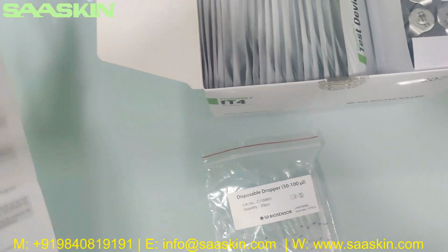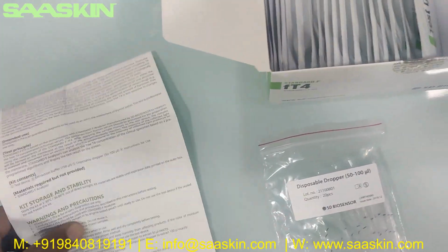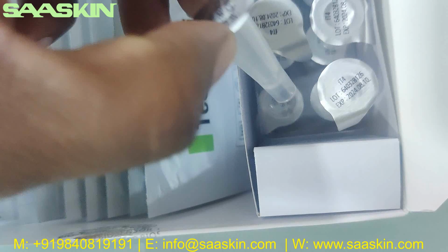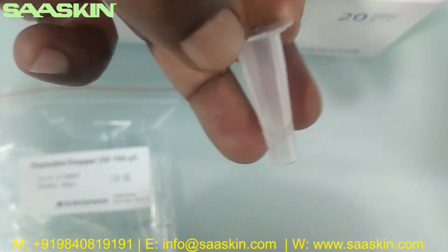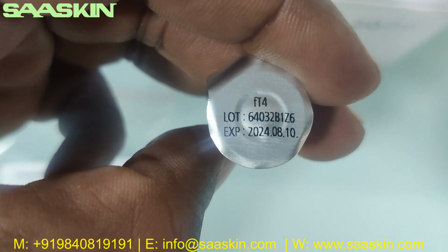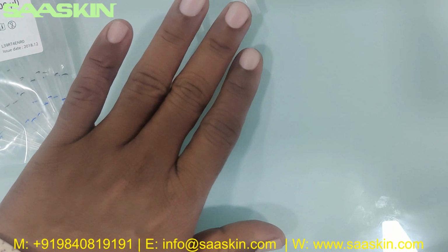Okay, let's look at this here. Okay, let me keep this here. And inside you can see there are 20 extraction buffer, 10 on the top row and 10 on the bottom row. This is how the buffer looks like, the extraction buffer. You can see on the buffer you get the fT4 and lot number, and also the expiry period is written. So you have the buffers here. You can just keep these two and I can keep it here to show the buffer looks like.